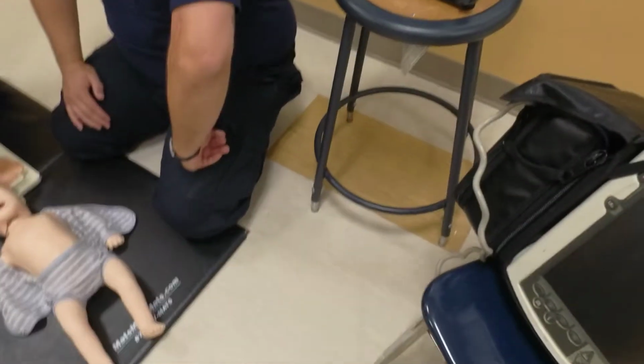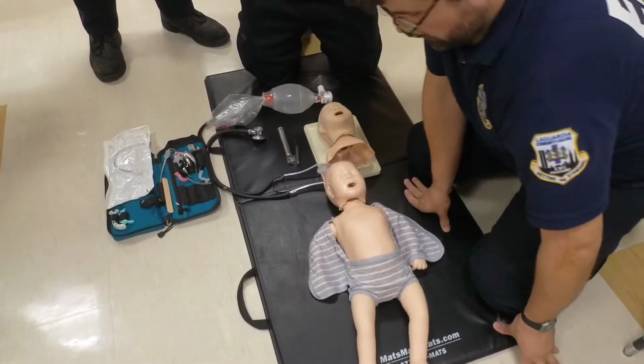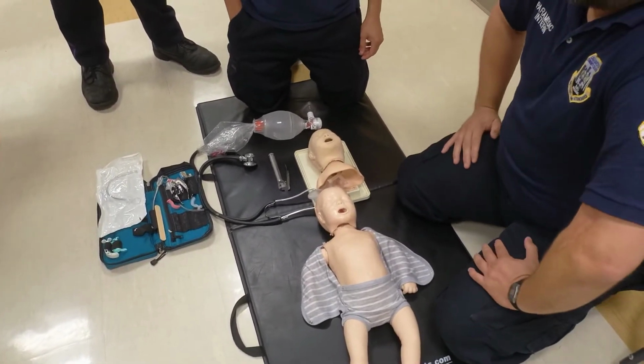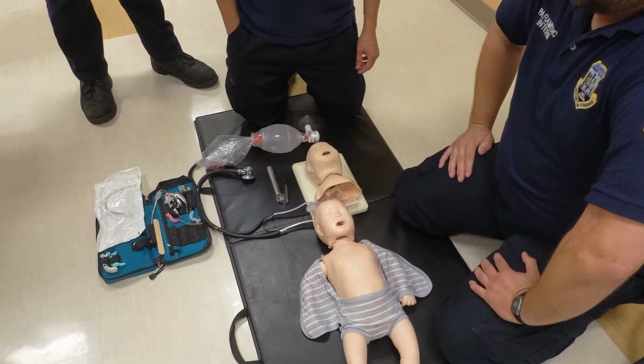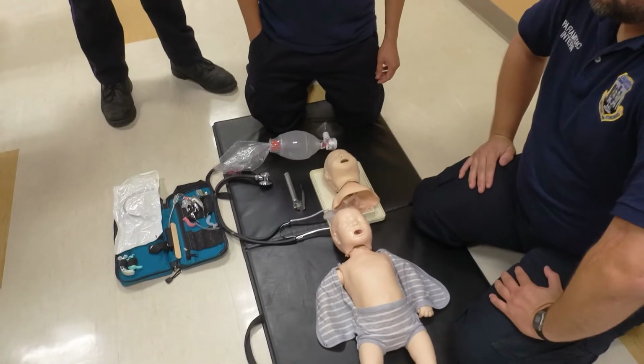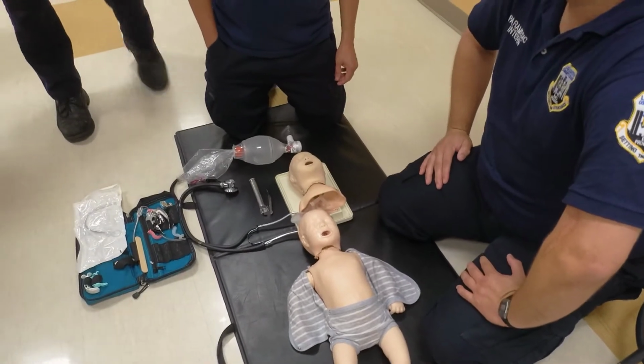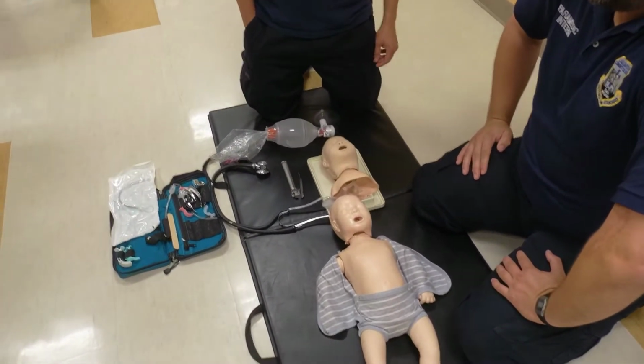You guys are using the monitor. Remember, it's weight-based settings, right? For defibrillation, what are the joules? It says 0.5. Not for cardioversion, but for defibrillation. 2, 4, 6, you got it. 8. That is how we defibrillate. Right, 10 is the max. Cardioversion is 0.5 to 1. Second one is 2 joules.